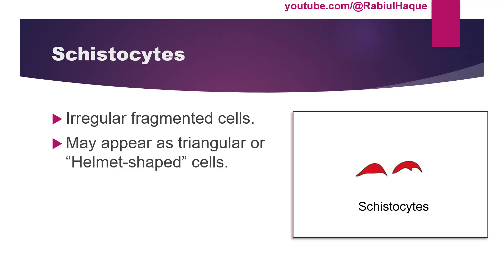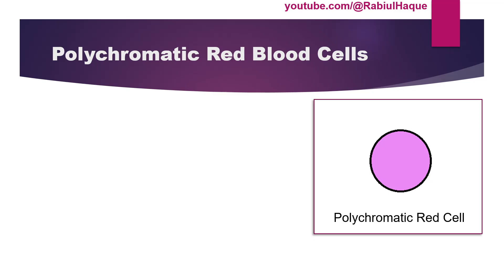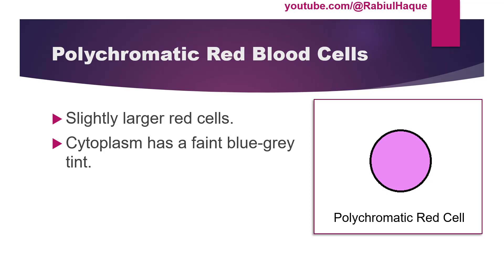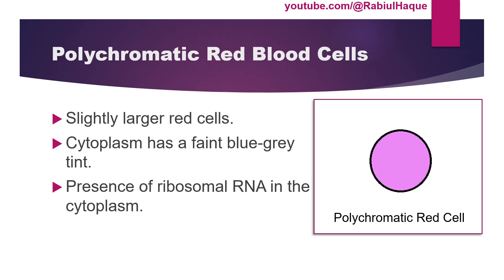Another term is polychromatic red blood cells. These cells are slightly larger than typical red blood cells and will have a faint blue-gray tint in the cytoplasm due to the presence of ribosomal RNA. Polychromasia means multiple colors, so these red blood cells will not only have reddish cytoplasm but also a faint blue-gray tint.